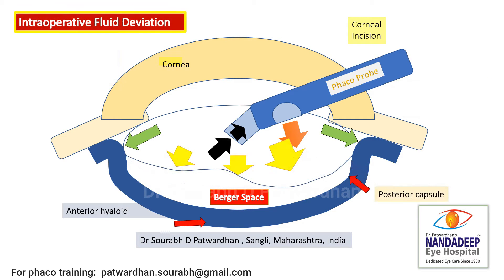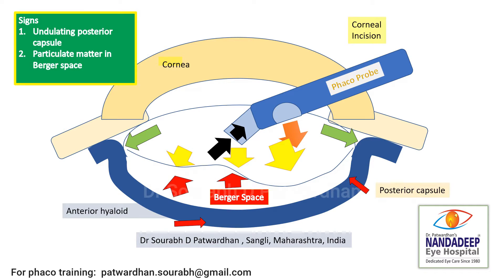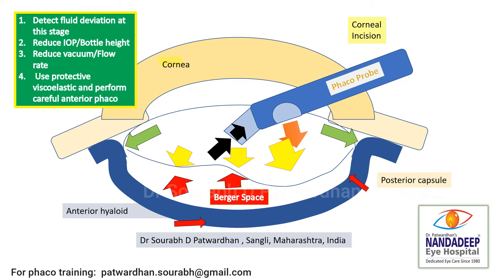The fluid keeps accumulating in this space and subsequently there will be anterior push of the posterior capsule. Because there is fluid on both sides of the posterior capsule and it is no longer supported by the anterior hyloid, the posterior capsule becomes more redundant and there will be an undulating posterior capsule. You can also see some particulate matter or debris in the Berger space, indicating that the anterior hyloid has now separated from the posterior capsule. It is important to detect fluid deviation at this stage.